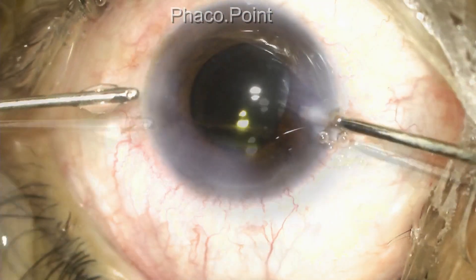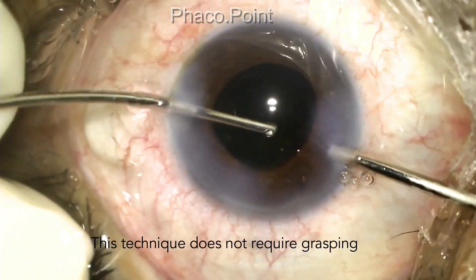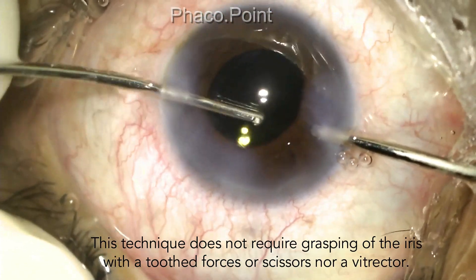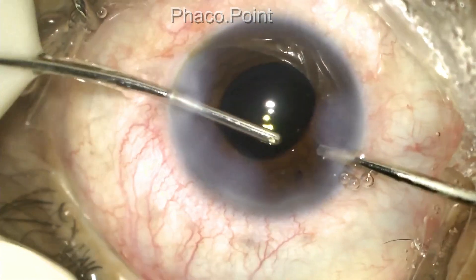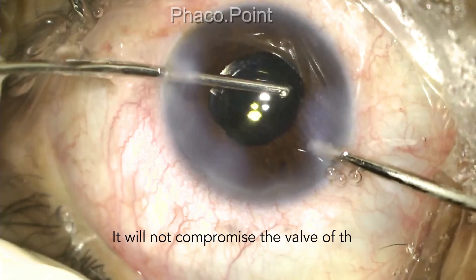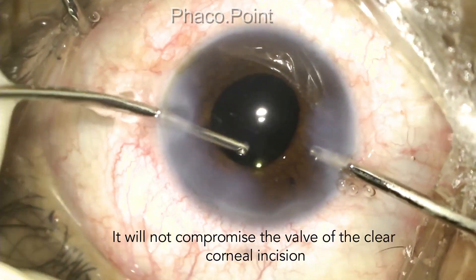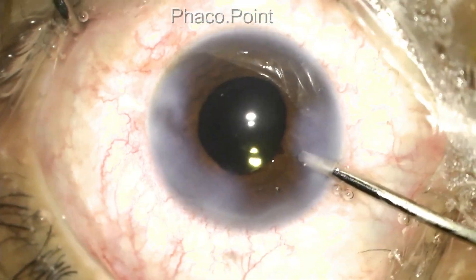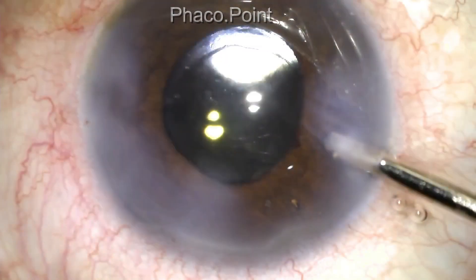Upon the completion of the surgical iridectomy, the excessive viscoelastic is washed out of the anterior chamber. You can now clearly see an adequately sized opening created in the peripheral iris.